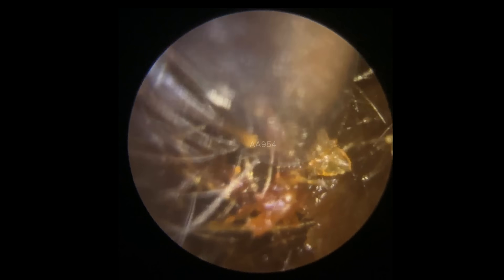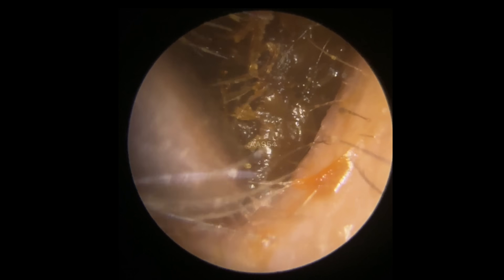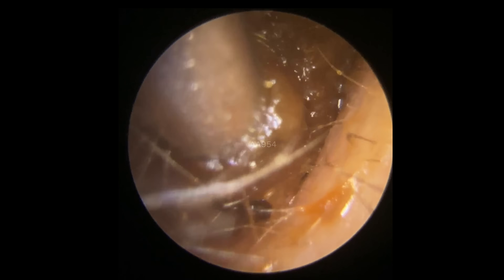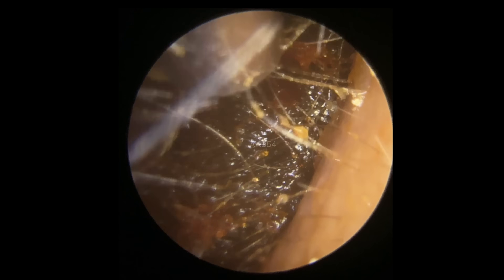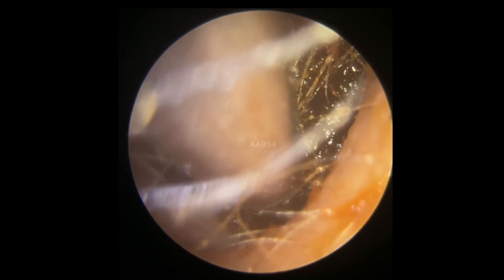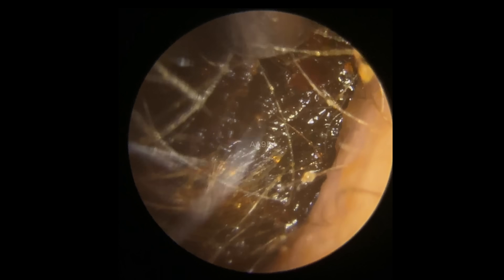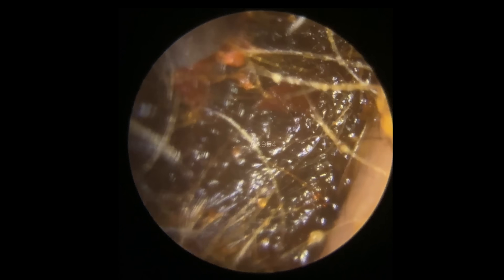With this patient here you can see we've got this really thick sticky plug of wax — quite big old plugs in this ear canal as well. They're kind of bound together with a little bit of hair, and that's just giving this plug a little bit more structure. I'm trying to lift this off the canal wall and we can see this very soft wax here at the entrance. The patients have used some olive oil before coming along, but this is pretty much filling the canal, and because the plug is quite long it's actually formed into the S-shape of the ear canal.